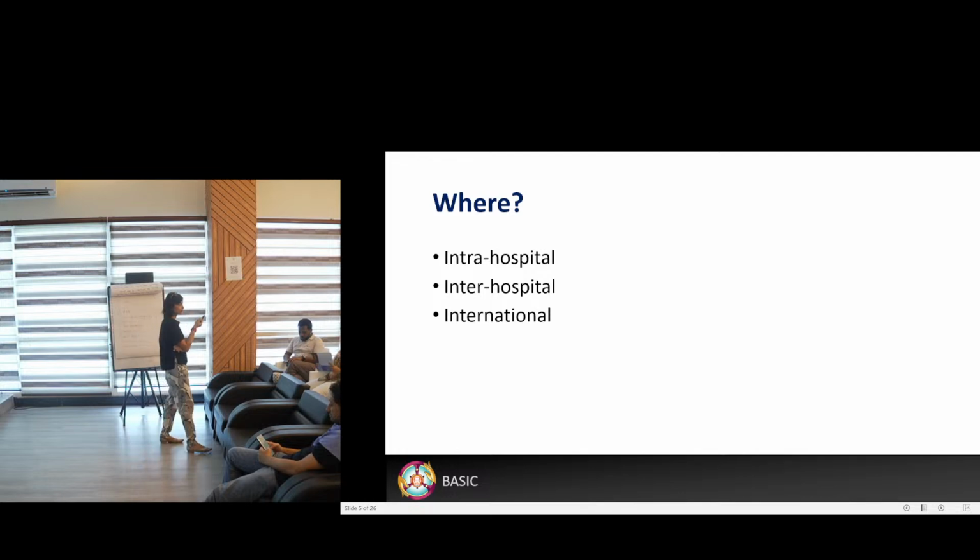Sorry? Vent, did you say? The ventilator, yeah. You need a portable ventilator, definitely. Nobody's bagging this patient all the way down. Sometimes people bring a patient from theatre, they've just bagged them down because it's like 100 meters or less. And it's fine if your patient's otherwise on low FiO2 and you don't need to worry, but this patient's on 50%. If I start bagging her, I'm tied to the bed and I can't do anything else. And nobody's going to bag her all the way down, so a ventilator. With battery that is charged. Okay, good. What else?